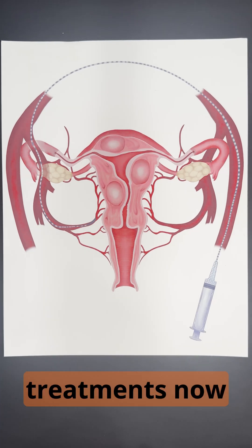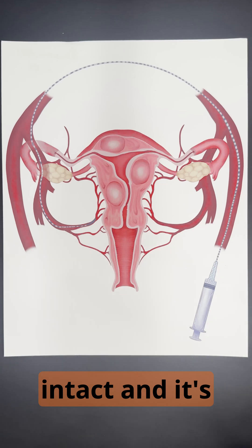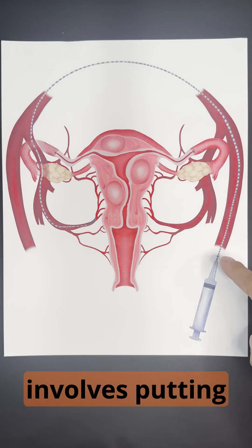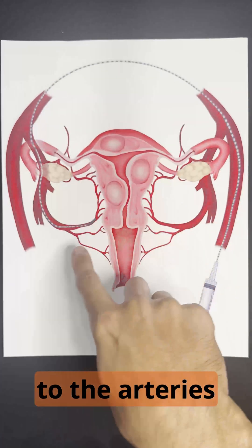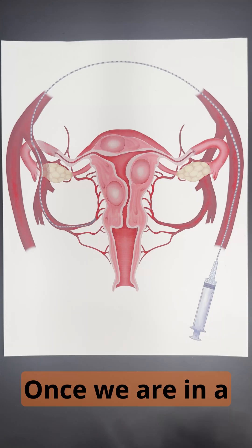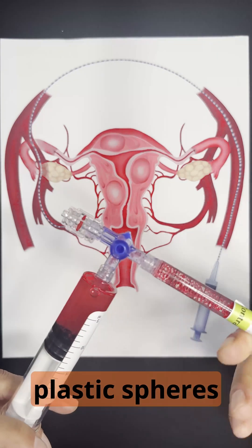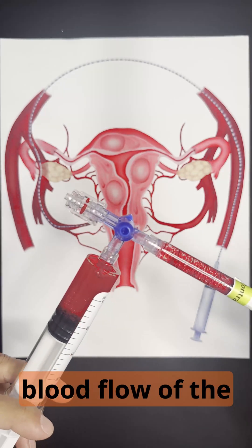But there are new treatments now that allow women to keep their organs intact, and it's uterine fibroid embolization. This procedure involves putting a small tube into the artery at the top of the leg and running it over to the arteries that supply the uterus and the fibroids. Once we are in a good position, we'll begin to drip these small plastic spheres that are a half millimeter in diameter into the blood flow of the fibroids.